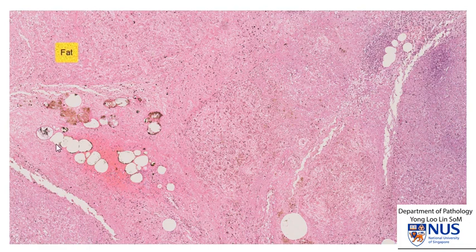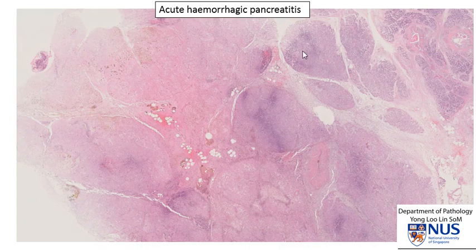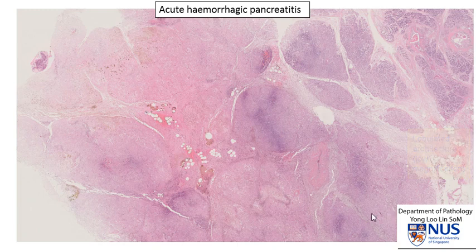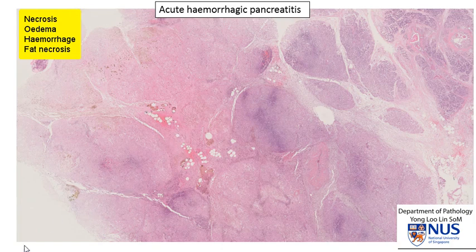Microscopically, there is some residual fat, and all these areas have been destroyed by enzymatic action. The tissue is necrotic, and you can't really see the nice outlines of pancreatic acini and ducts. Here at lower magnification you can see the preserved lobulations of the pancreatic tissue, and then the area that was destroyed by enzymatic digestion, giving rise to necrosis, edema, hemorrhage, and also fat necrosis.